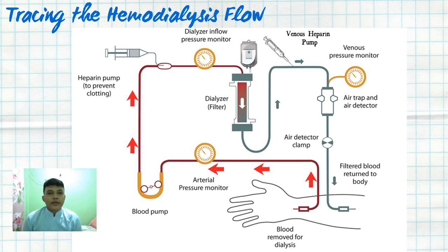After identifying the arterial access, the red line represents the arterial blood line, which is then inserted to the dialyzer, wherein it sends blood back to the venous access. Then the blood pump machine is utilized, wherein it slowly draws out blood, which is then sent to the dialyzer.